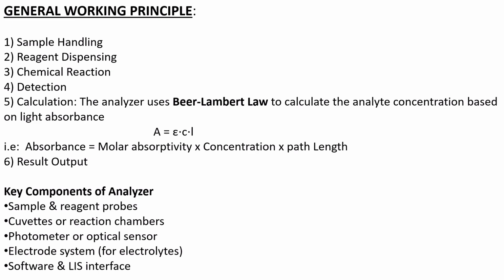In sample handling, the machine will aspirate the sample and add it to the reaction cuvette. Then there is reagent dispensing, where the reagent probes will dispense the reagents into the reaction cuvettes. Then there is a period of incubation and reaction, where the reaction will happen between the reagent and the analyte under controlled temperature in the reaction cuvettes.